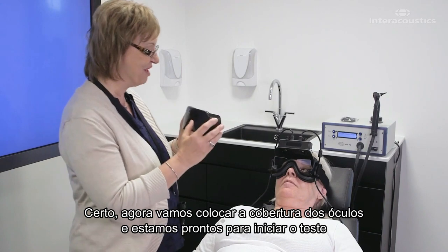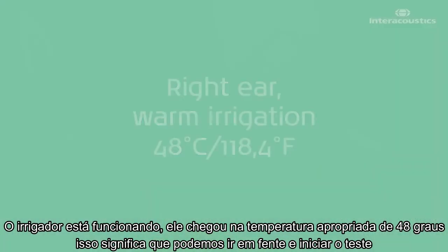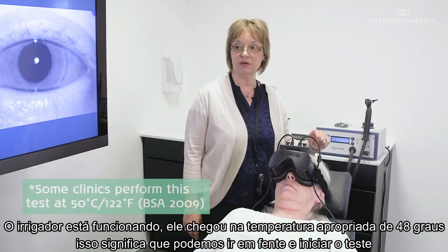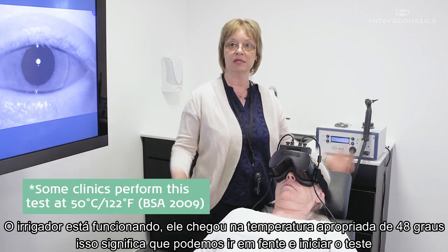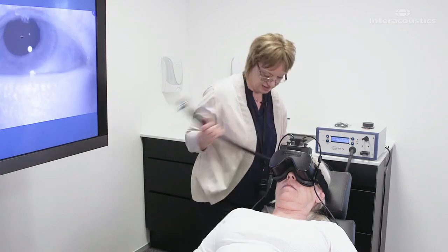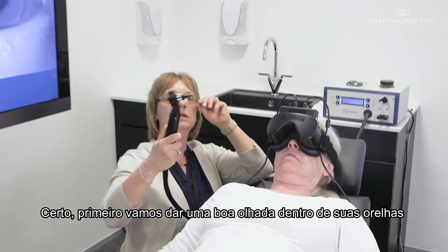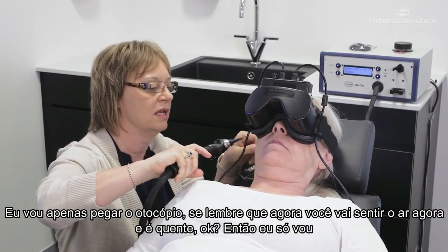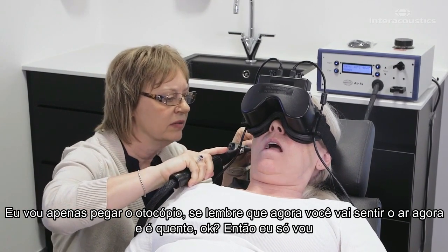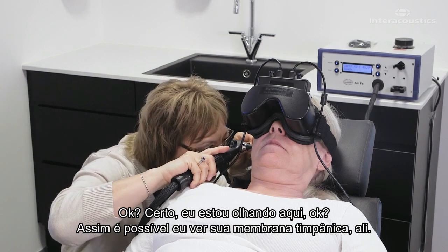All right, then I'm going to put the cover on and we're going to get ready to start the test. So the irrigator is now running. It has reached its proper temperature of 48 degrees — it beeped, which means I'm ready to go ahead and start the test. Are you ready, Tess? First, I'm going to get a really good look in your ear, so I'm just going to take the otoscope. Remember, you're going to feel that air now and it's warm.